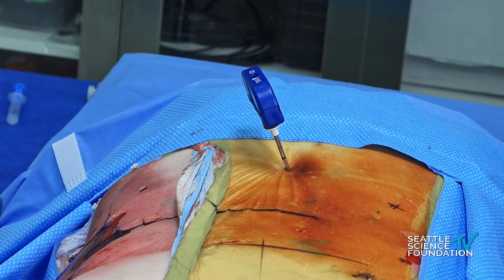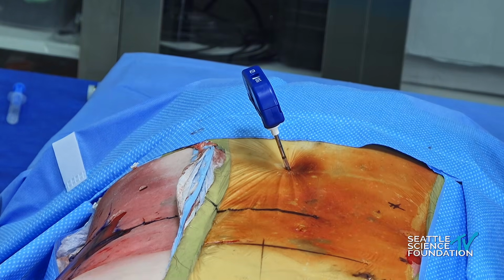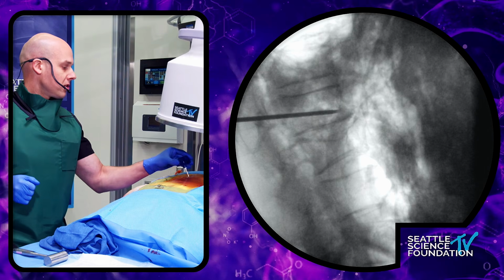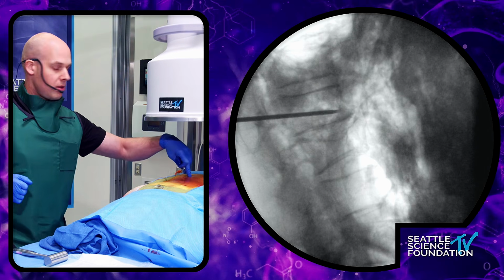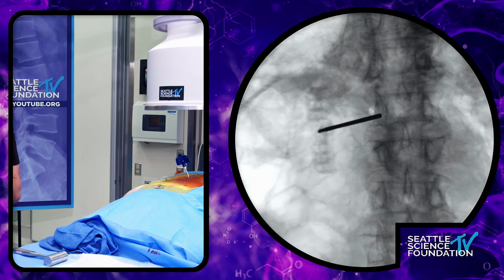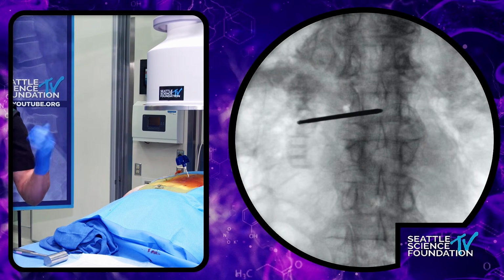So we can go back AP just to show we should be either at midline or even a little bit crossed over the contralateral side. So very good position here. What we'll do, perfect. So right in the midline here. So I'll grab the Kyphoplasty balloon.